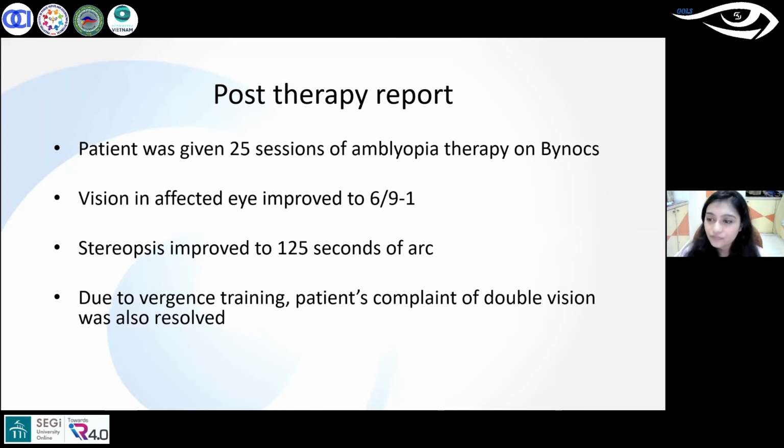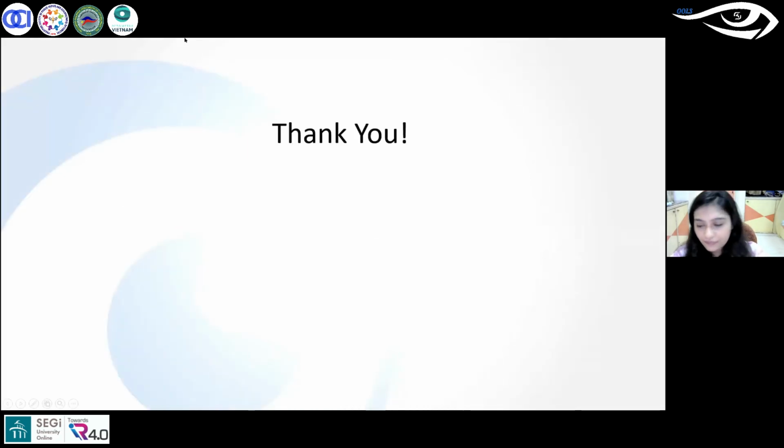Okay, Jinal, thanks. I think this was quite a short one, but you did make a point that there are many treatments of amblyopia available, and you had quite a good experience in terms of using Binocs. I think a lot of people would have some questions on what is Binocs and how Binocs works. Would you like to give a short gist about how Binocs works? It of course works on the dichoptic phenomena, and I think you did mention that you use red and green filters, and then you let patients, you know.